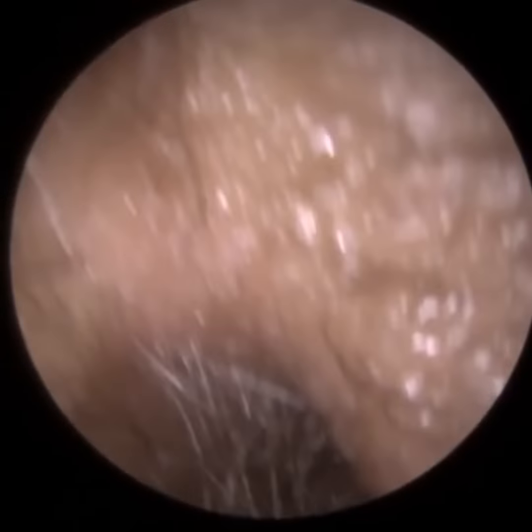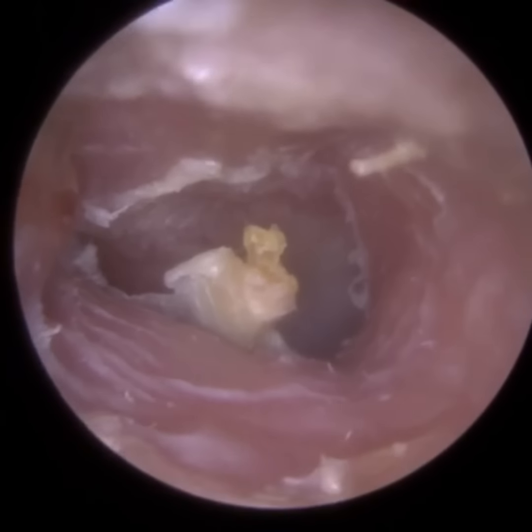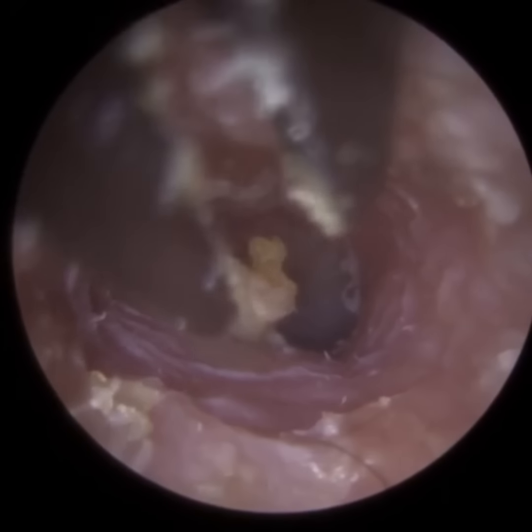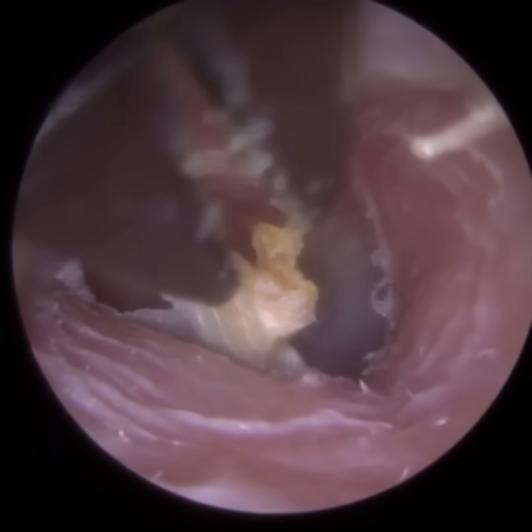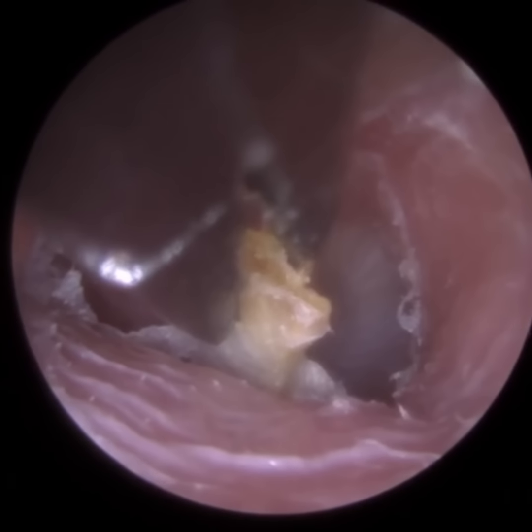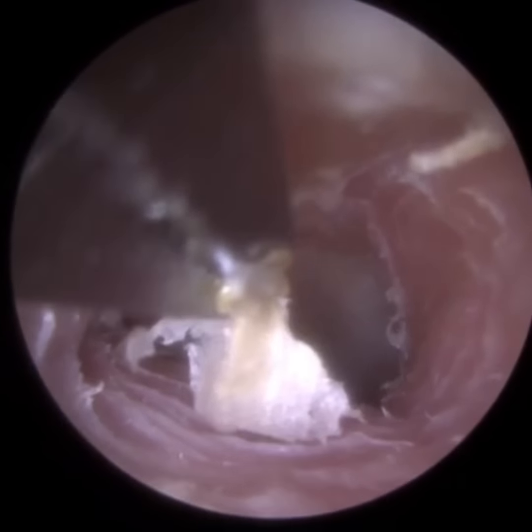There's quite strong adhesion there, so I've just lifted it off the canal wall. There's something for me to clasp onto and grab onto, so I'm going to go back in with the forceps. Just got to be careful because we're really close to the eardrum now. We don't want the tip of the forceps, which is the pointed bit, to make contact with the eardrum or the ear canal wall. And there we are. I've managed to remove that last sliver of dead skin.